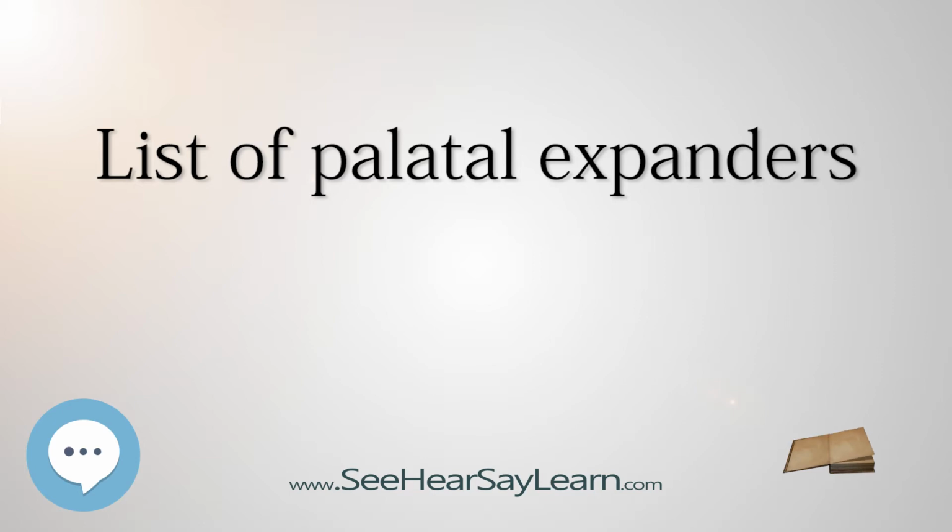Rapid vs. slow expansion. A study published by Martina et al. stated that rapid maxillary expansion is not more effective than slow maxillary expansion in expanding the maxilla in patients with posterior crossbite. It is important to keep in mind that different studies use different rapid and slow expansion devices and thus comparability between studies is difficult.